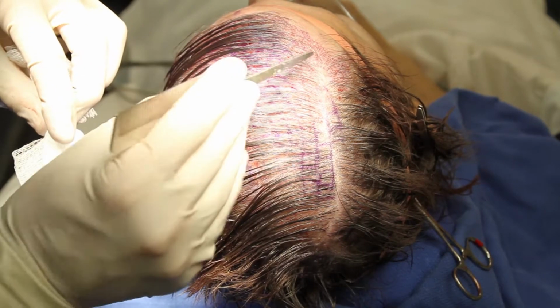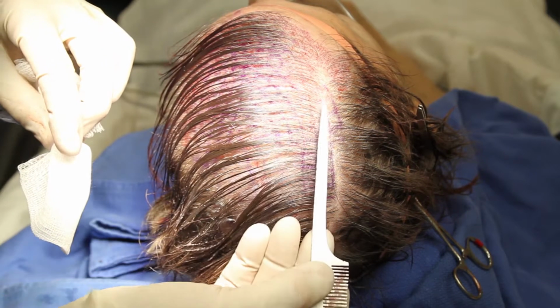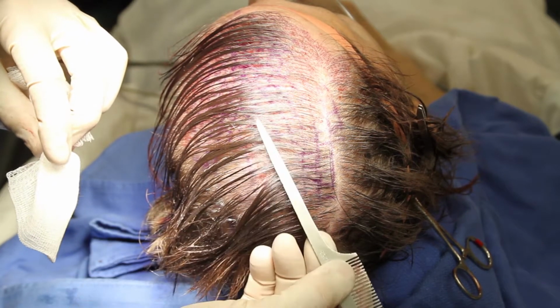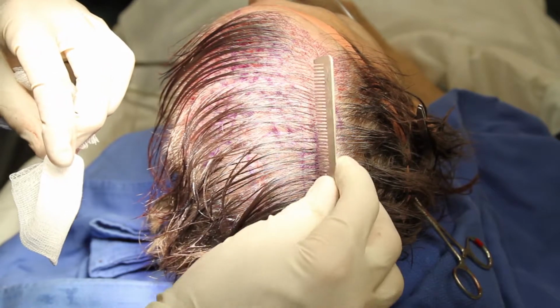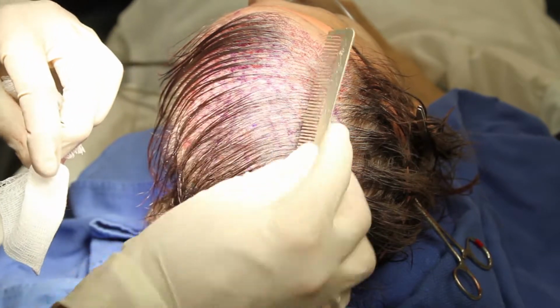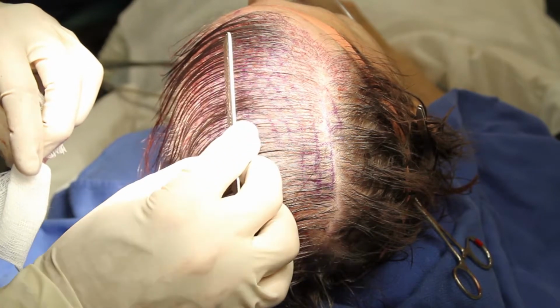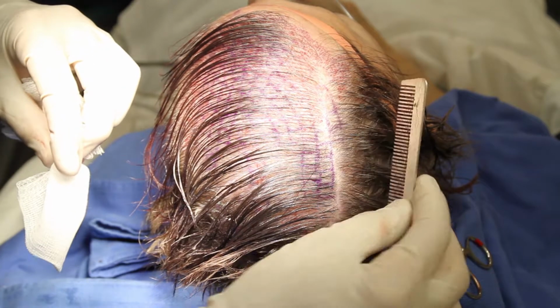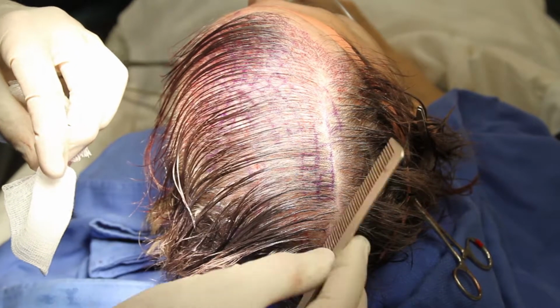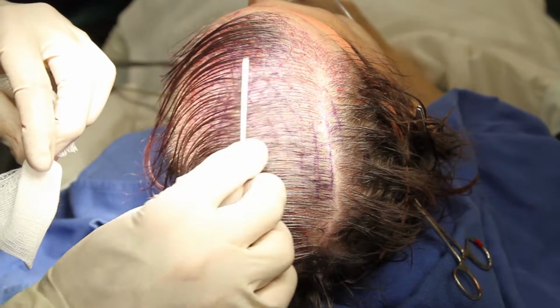And you can see already along here I've got my nice density in the frontal hairline, and as I work back here I'm going to make sure that we've got good density, because he's got reasonable density in between here, but I want to make sure that when he parts his hair he's not showing scalp. So we're going to work on grafting along here and in this segment here in the box, and get some more density here, so that from his natural part, this is about where he parts his hair, right in here, we've got excellent coverage of the scalp.